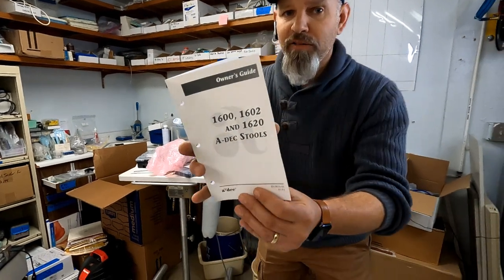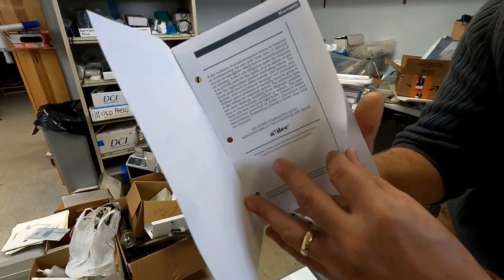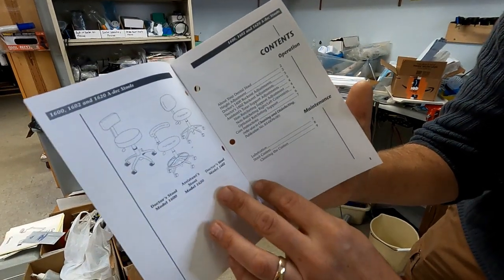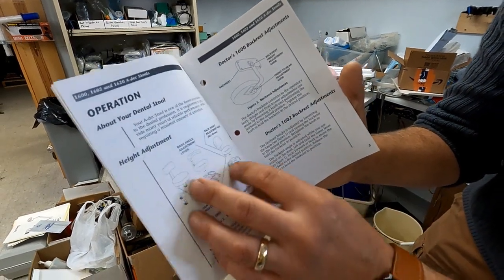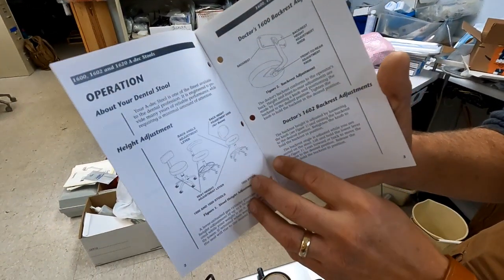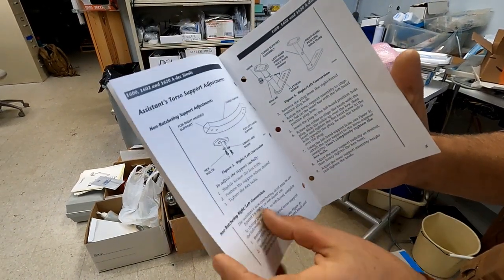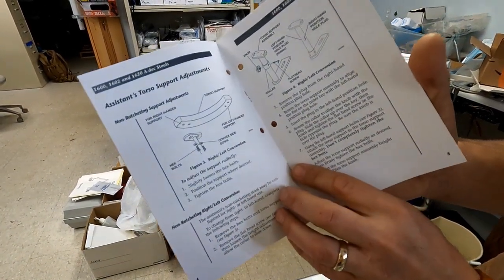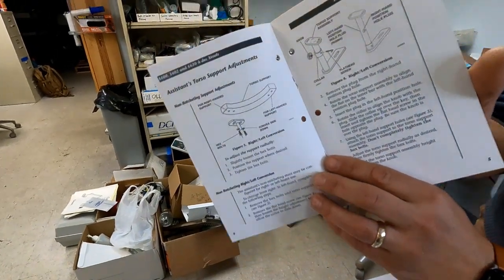So with that aside, what really struck me about this book is that as I was flipping through it, I found all the normal things that you would find. There's a warranty, there's a table of contents, there's some pictures of some stools, there's operation, height adjustment, backrest adjustment. There's all these types of things. There's how to change from left to right.